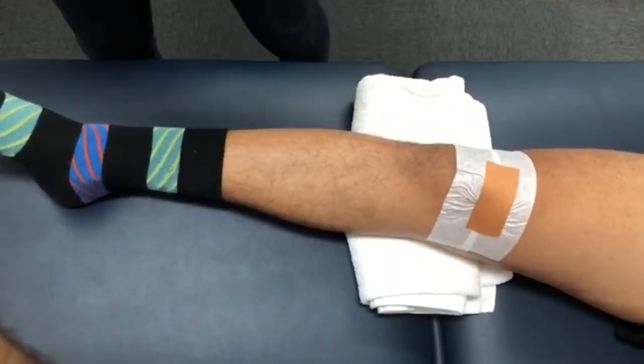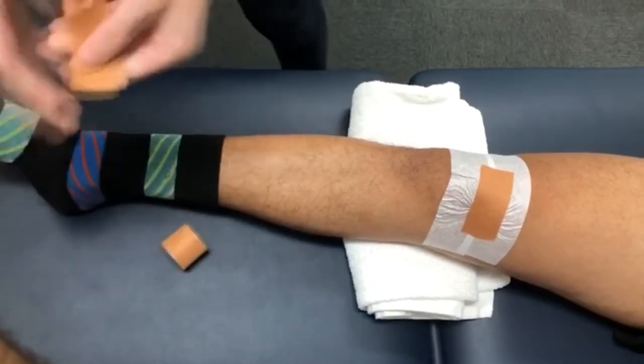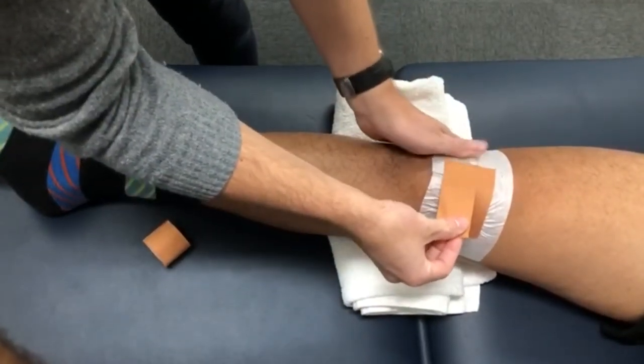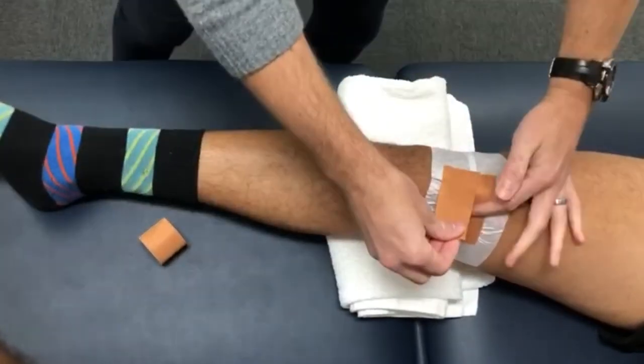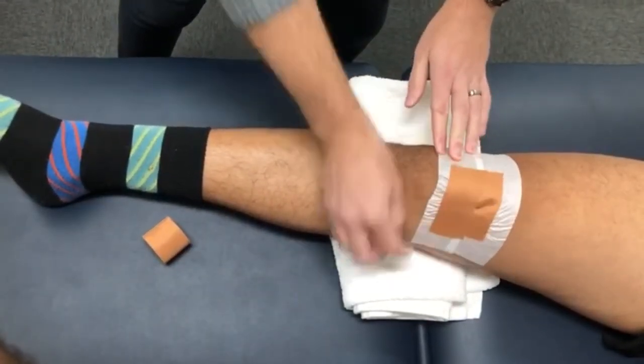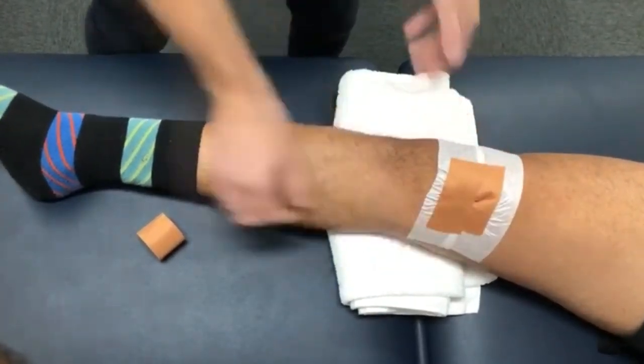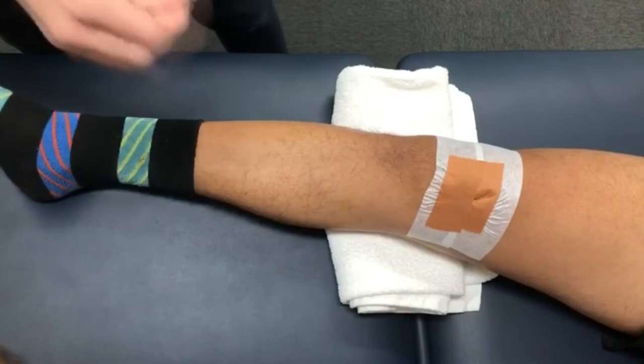Now we're going to repeat the process, this time cutting another piece of rigid tape and covering the other rigid tape we've just put on by around half. From the middle of the kneecap, hold that pucker there and then paste it down on the inside of the knee as shown, rubbing it all so it heats up and sticks really well.